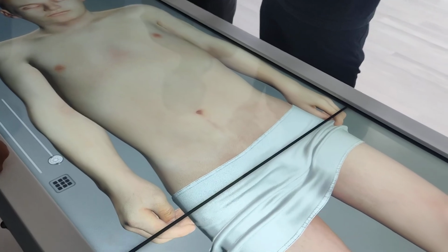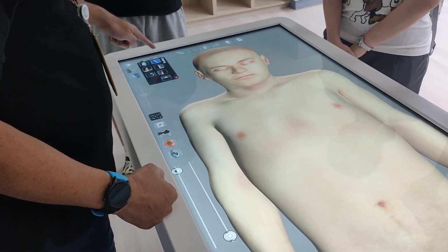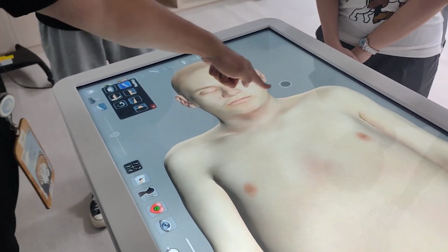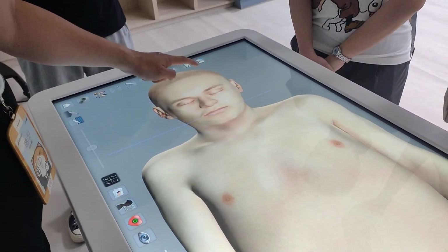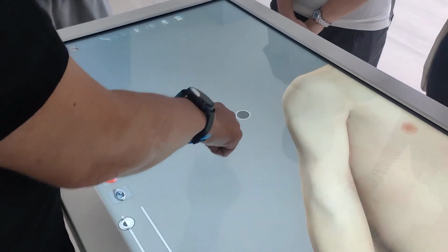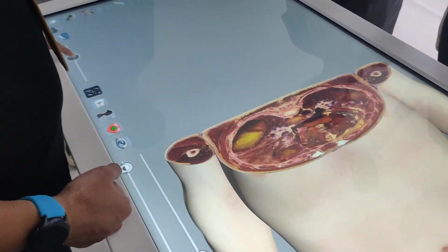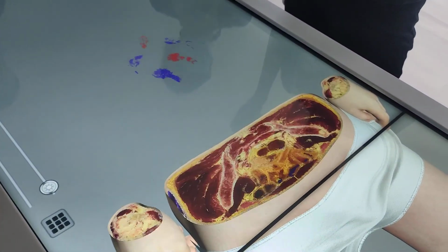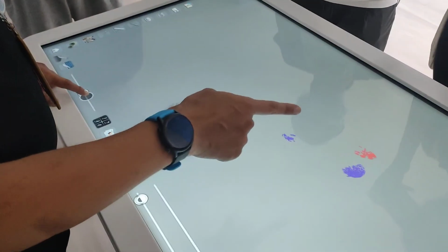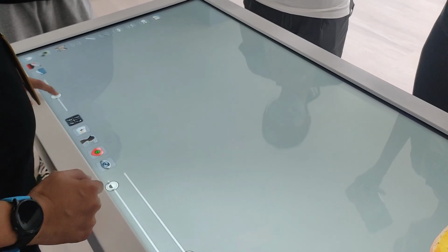Okay. So if you want to see like this, this is clipping. So use the knife to cut here, okay, and push here. See, you can see the transverse section. Okay, simply you chop the head from the cadaver, and you can do different places. Just simply move this button. This is the heartbeat. I don't want to see it.